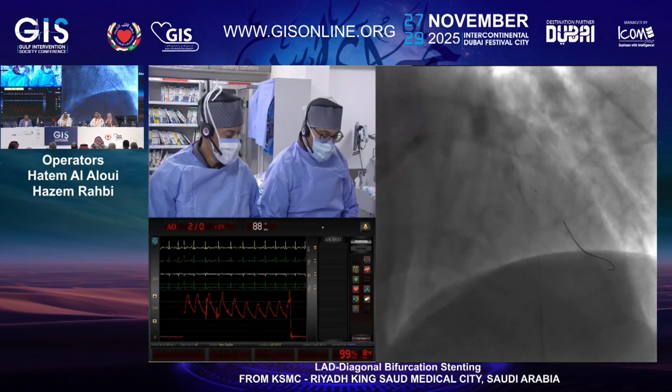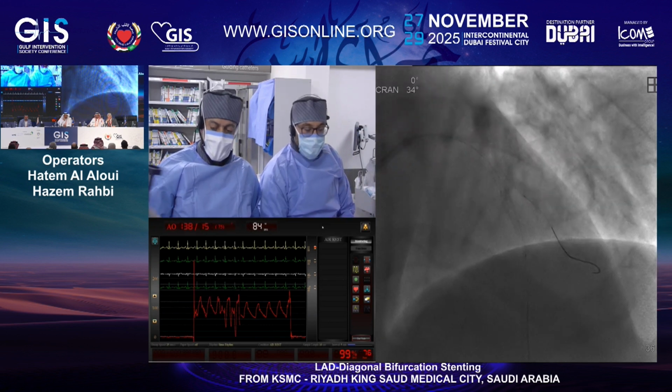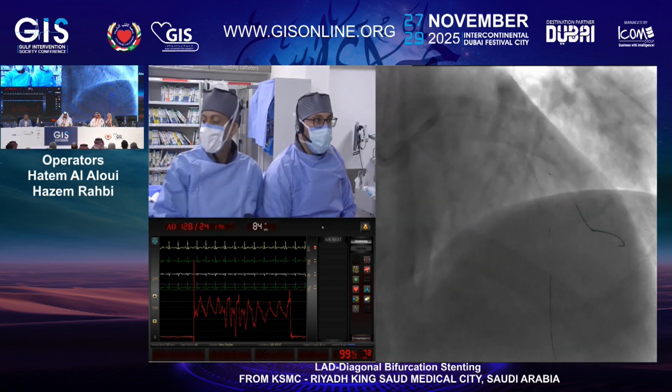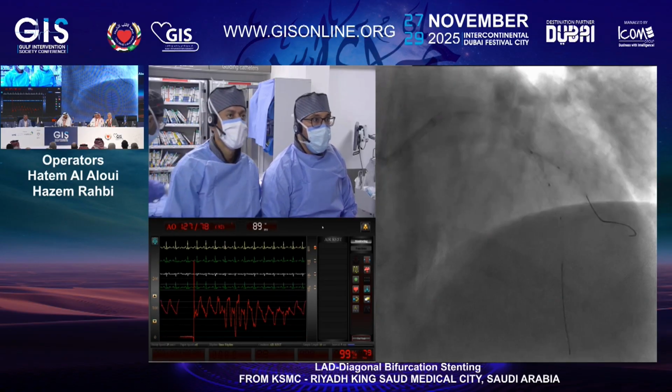I won't do anything on the diagonal as we agreed from the beginning. We preferably not finish with the kissing here. Prepare the IVUS. Dr. Habib, okay.